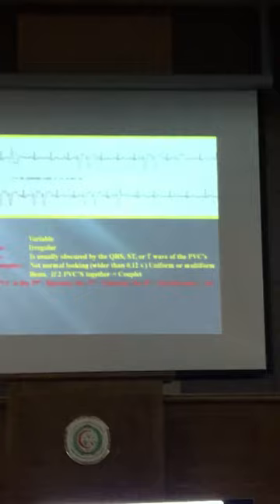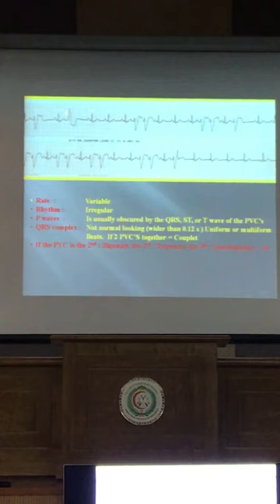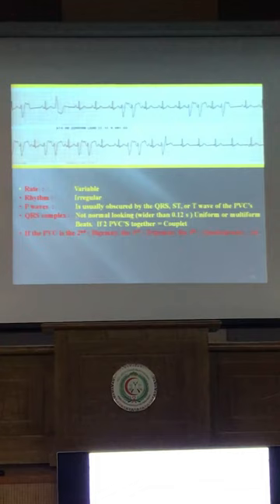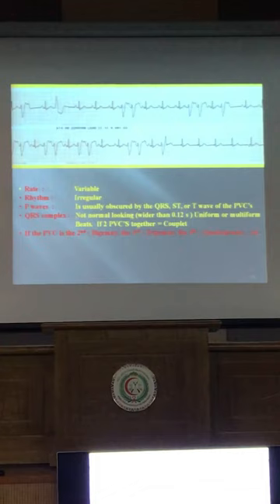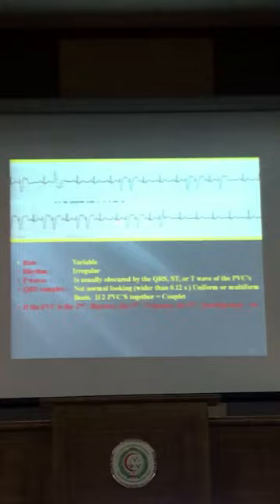If it's the same focus it's unifocal; if different morphology it's multifocal. Second question: is there a couplet? Meaning two PVCs together. Third question: is there a pattern? For example, one normal sinus beat then one premature — alternating — this is a bigeminy pattern.